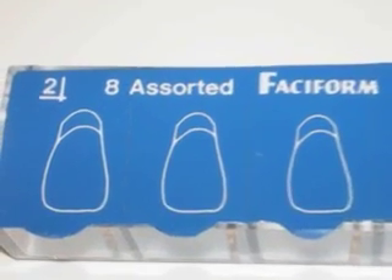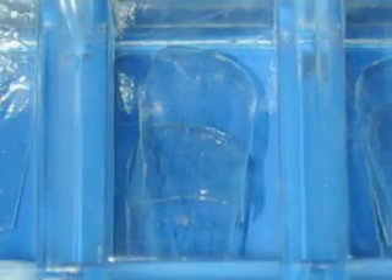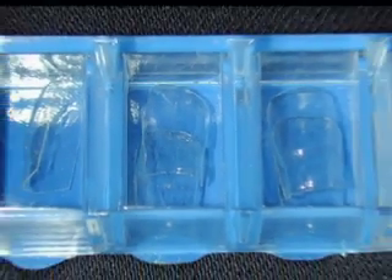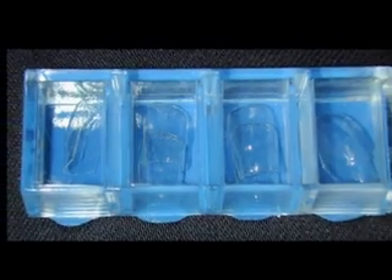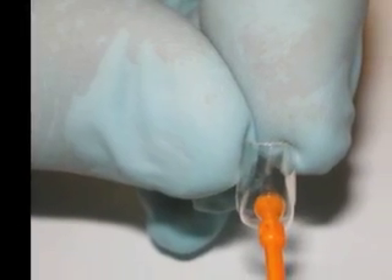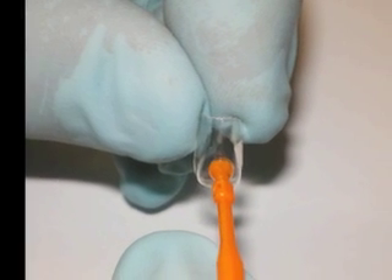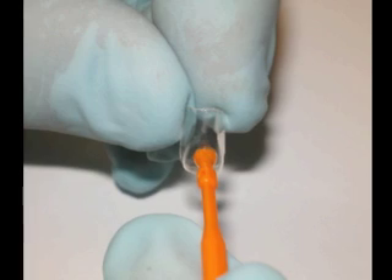We then peel back the blue cover and select the appropriate size Faciform for these teeth. The Faciform is the most clever part of the whole system because it allows you to create a perfectly polished and shaped labial surface to the veneer. At this point, I'd like to attach the Faciform with a small sticky wand so that I can easily hold and trim it.